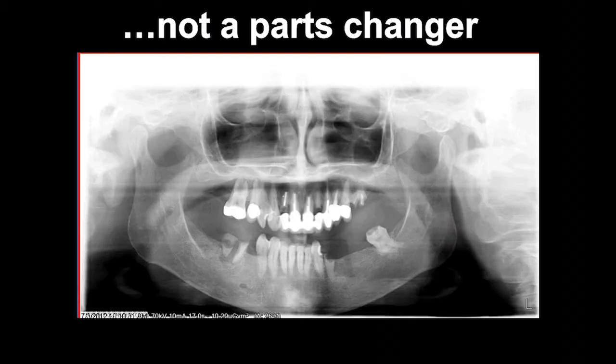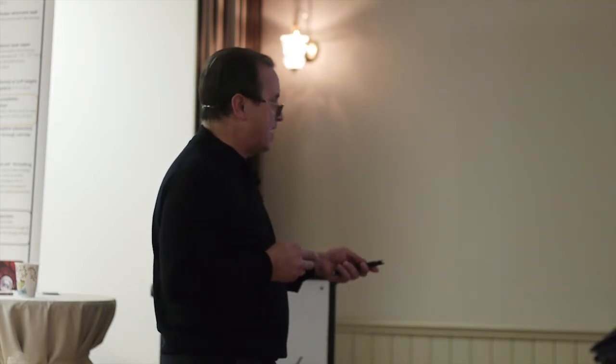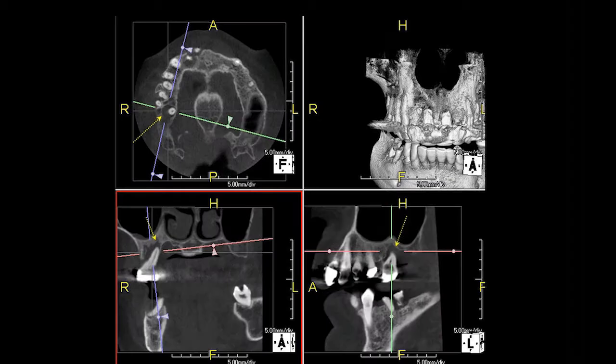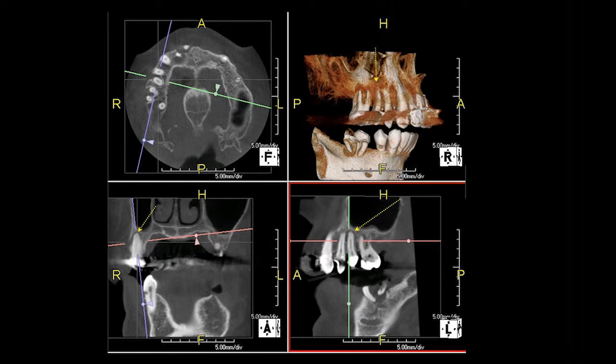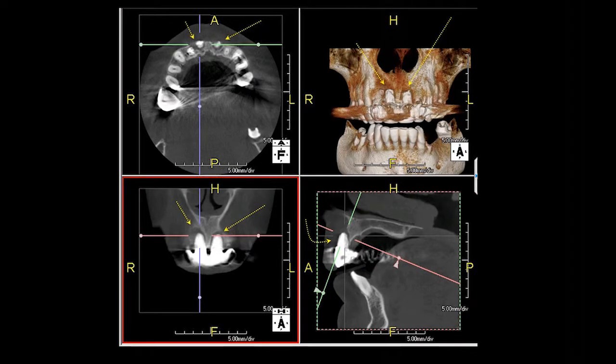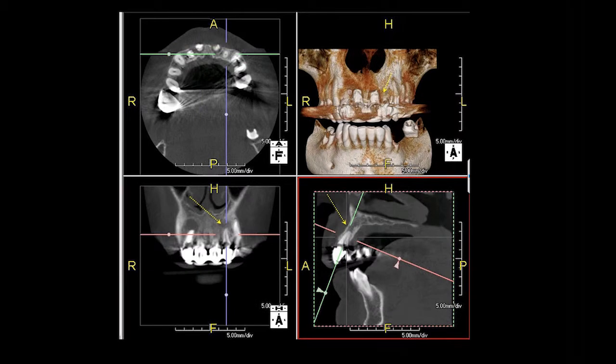And some people right off the bat say, well, just take out all the top teeth. Well, I wanted to hang on to a few of these to support her temporaries while the implants are integrating. So we looked at, and this is a case presentation. Okay, Ms. Fontenot, we got endo on both of these teeth. We've got some bone issues up here where this upper molar is. It's a big bad infection around that upper molar. Here's the premolar. And like I said, you can really see some stuff in cross-section that on regular PAs is not all that apparent. Got all this going on in the front.